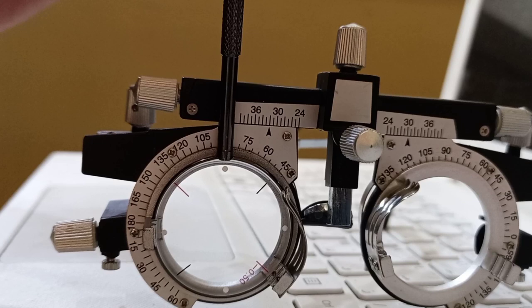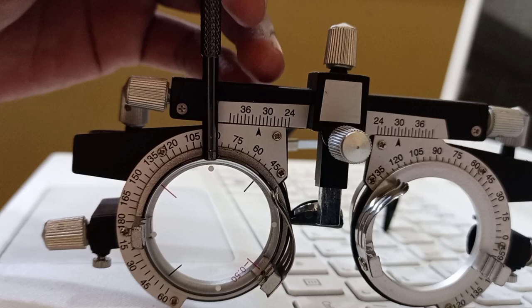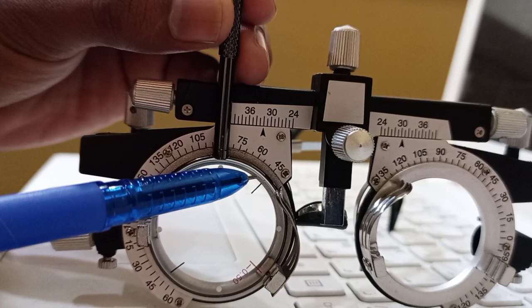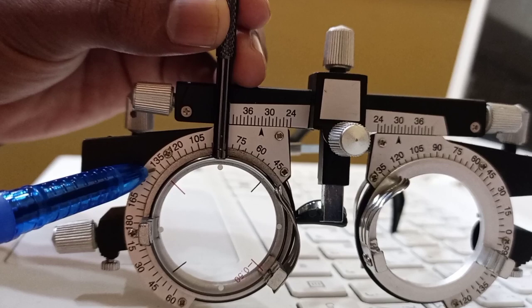In the procedure of bracketing we place the handle of the Jackson cross cylinder at different axes. For example, if I place the handle at 90 degrees, the axis of the plus cylinder is coinciding with 45 degrees and the axis of the minus cylinder is coinciding with 135 degrees.